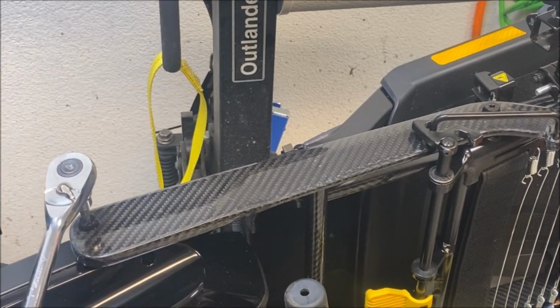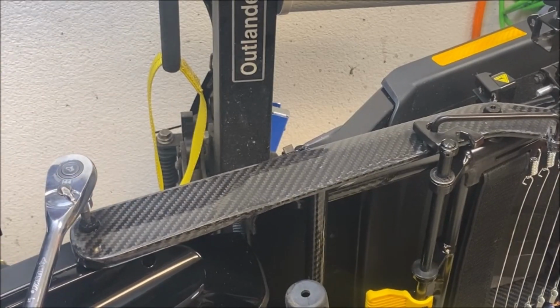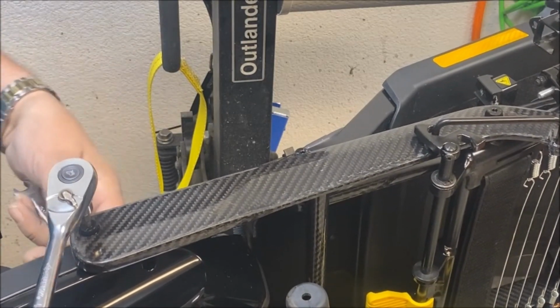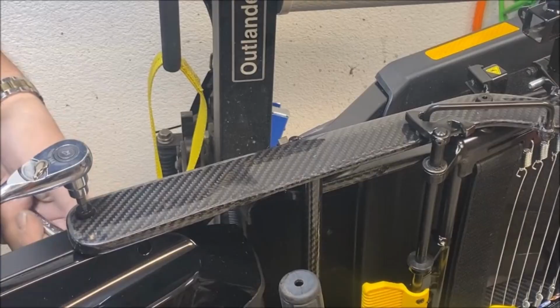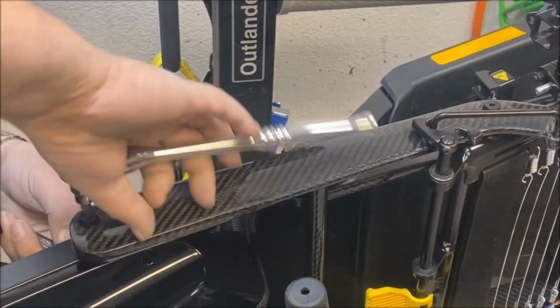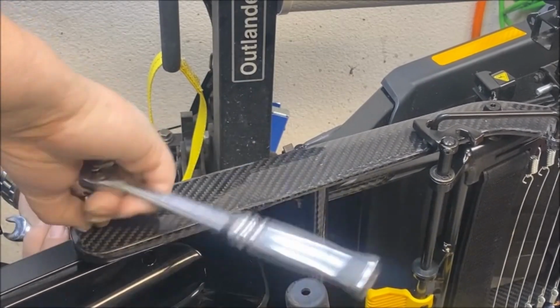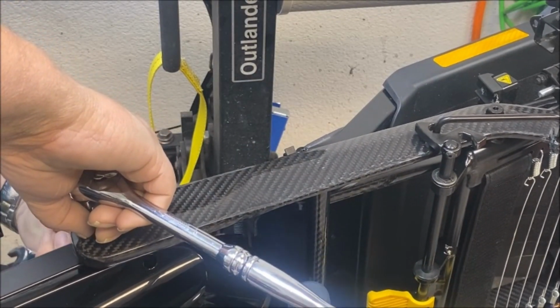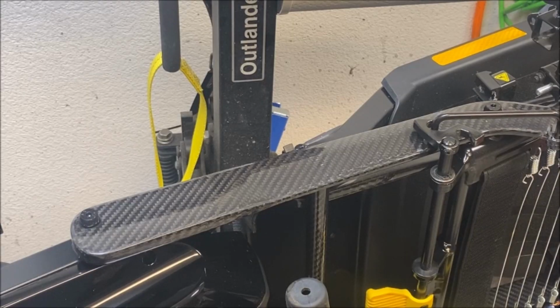It looks like a 10 or a 12 on the back of it. Guessing 12. Nope, 10. Because it has the pivot. Looks like a little acorn nut with a locking washer and a washer on there. And a spacer.